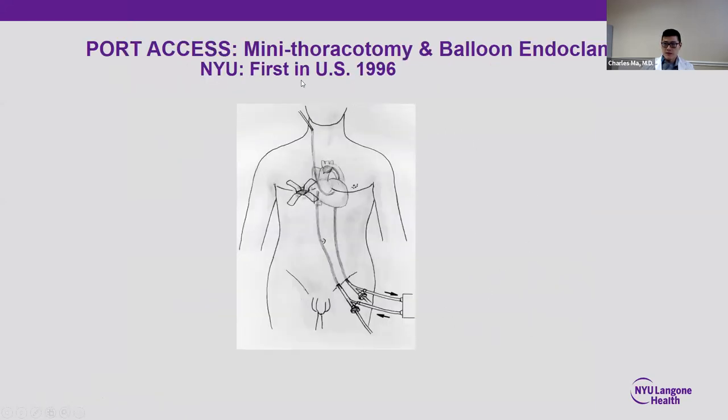So NYU became the first institution in the US in the 90s to perform a mini thoracotomy mitral valve repair. And this was made possible by new technology that had developed through the Heartport system device, which consisted of a coronary sinus catheter through the internal jugular vein that went to the coronary sinus.